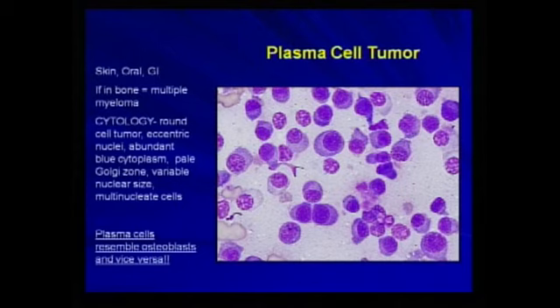Both are proteins, or compounds that will be excreted from the cell, so those materials are always made in rough endoplasmic reticulum. And if you look right by the nucleus, you will often see a prominent Golgi zone, or HOF.